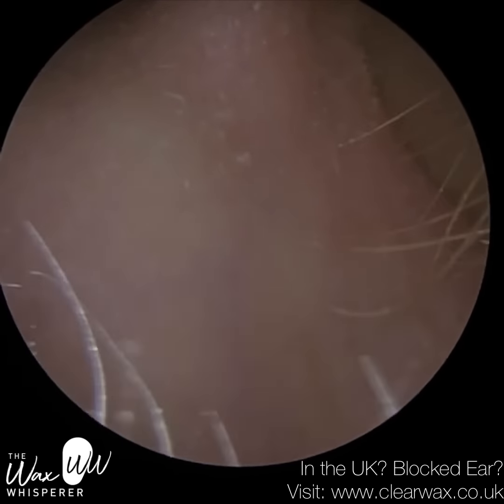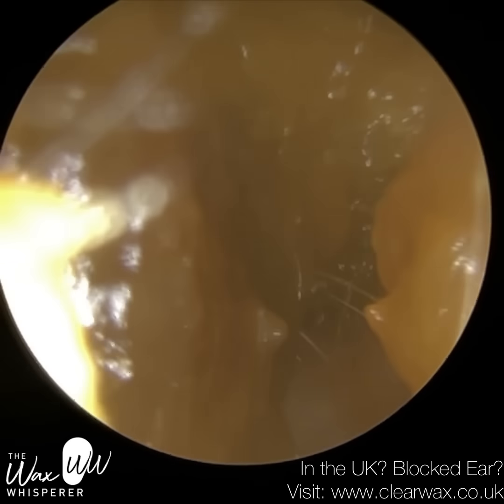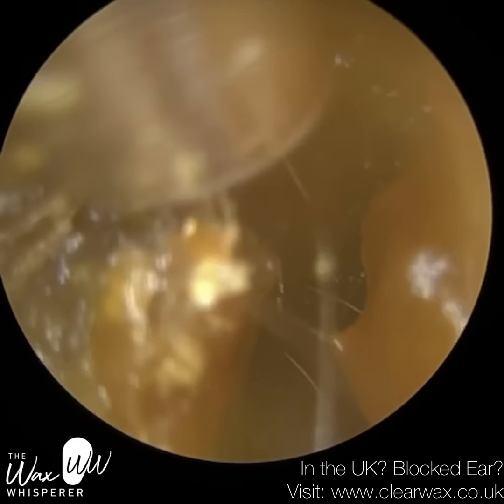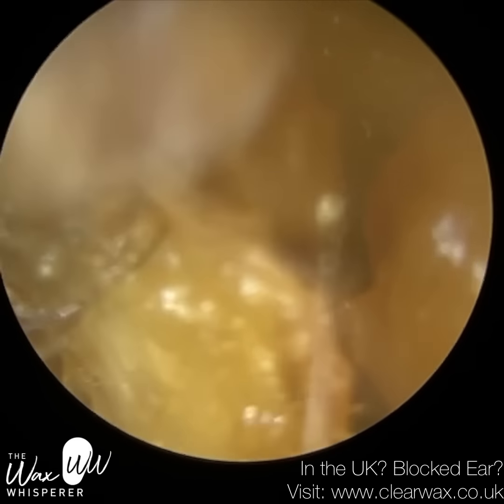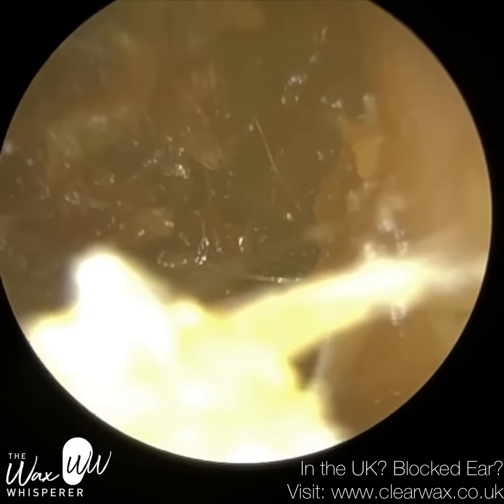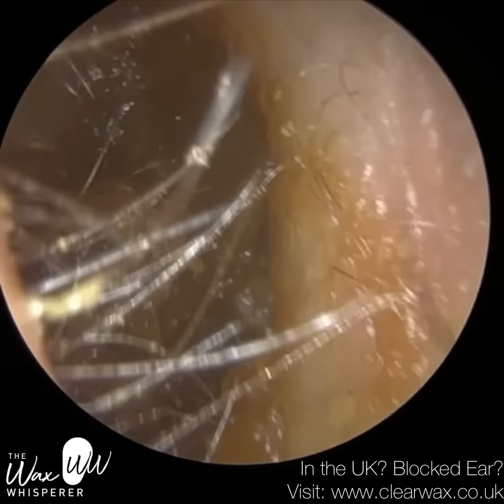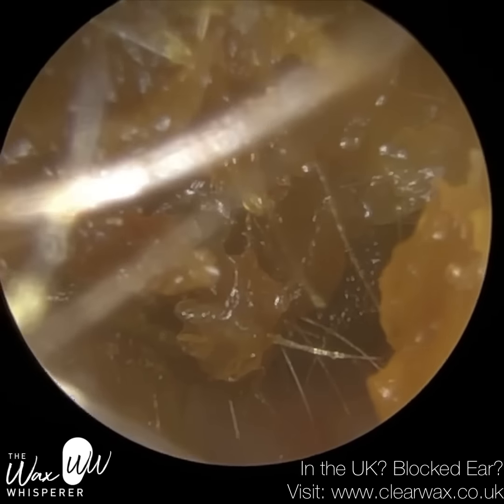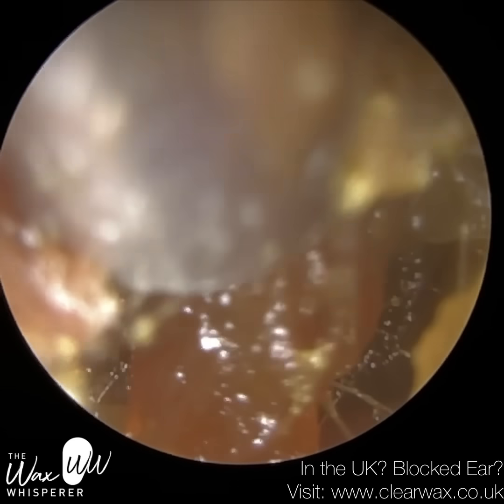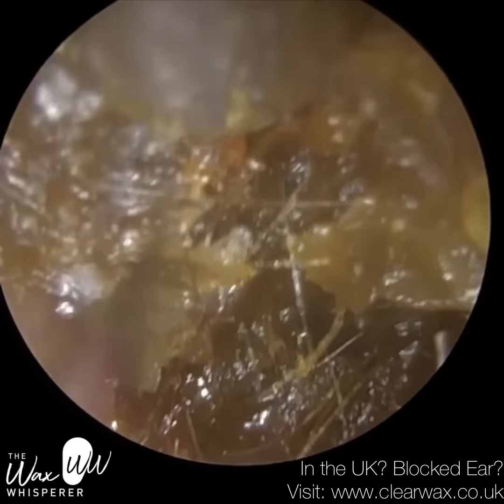I have a couple of patients for you in this compilation video, and this is patient 1 who attended with bilateral occluding earwax, and we're just commencing with their right ear first. They noticed their symptoms whilst on holiday. They jumped in the pool and their head got submerged under the water, and subsequently upon exiting the pool they felt that their hearing had become blocked in this ear in particular, and it's not returned back to its normal level.